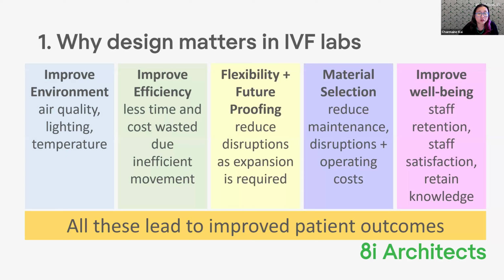Why we want to look at design in IVF labs is to improve efficiency within the lab, so there's less time and cost wasted due to inefficient movements. Improving efficiency not only allows staff to spend more time on doing the things that matter, not wasting time walking between spaces, between the ET room and the lab or the theatre and the lab, but spending time doing what scientists do best. This also reduces costs for the people that are financing the labs.